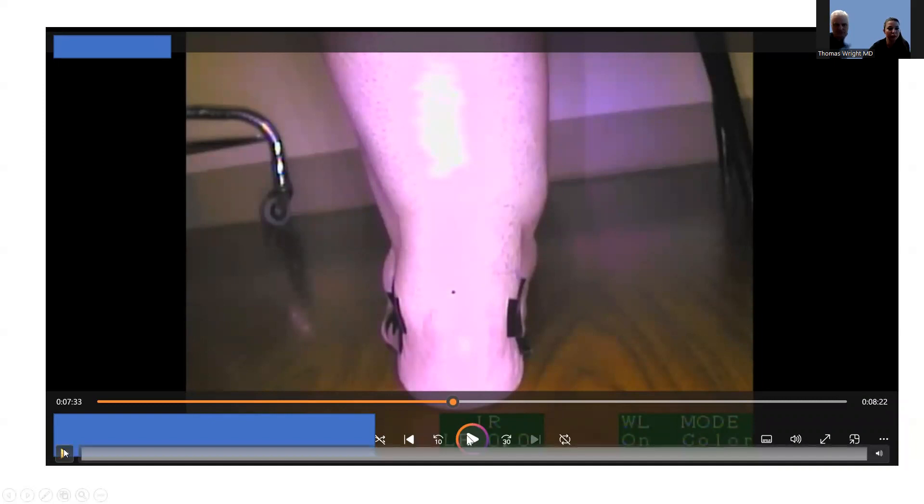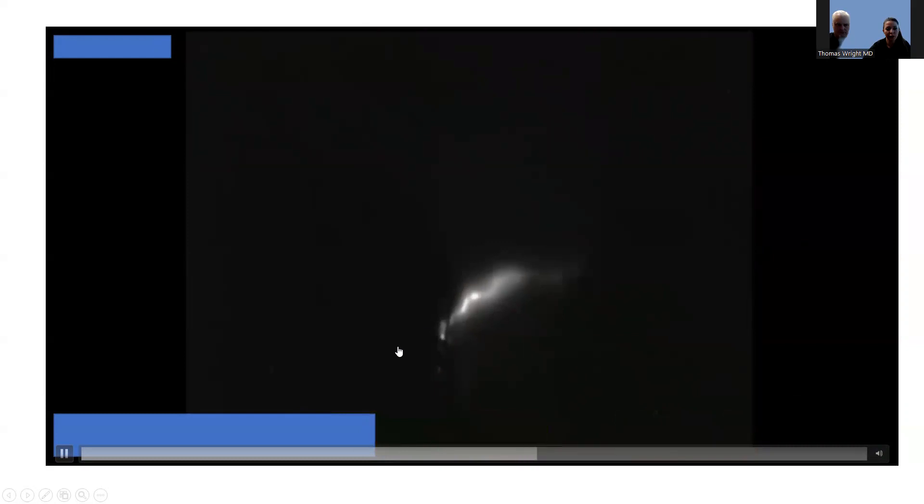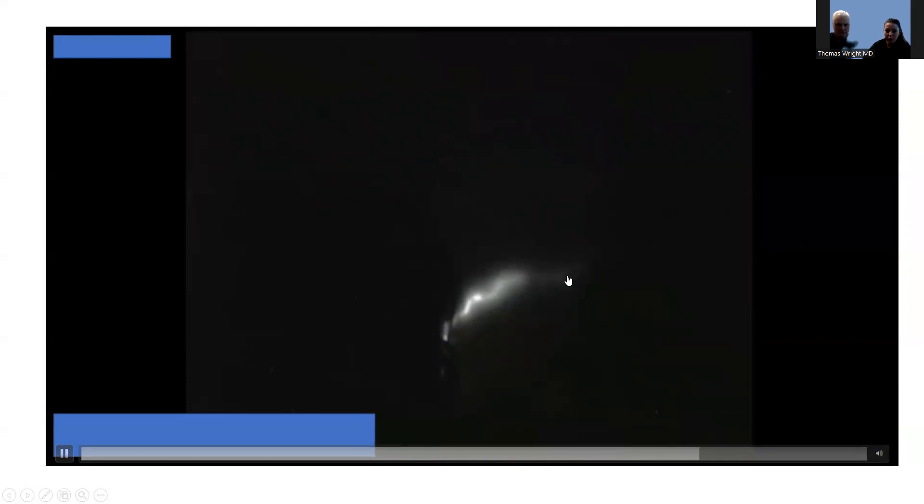The last one here is the same patient, but this is again that fourth zone, that posterior aspect. So started off in that color imaging here, so you can really have an understanding of what we're looking at before I switched the camera over. This is the back of her foot here. And you can see that cuff very well-defined, and that channel is just going right up around underneath and around that cuff and then nothing. And then there's no visible popliteal node for her either.